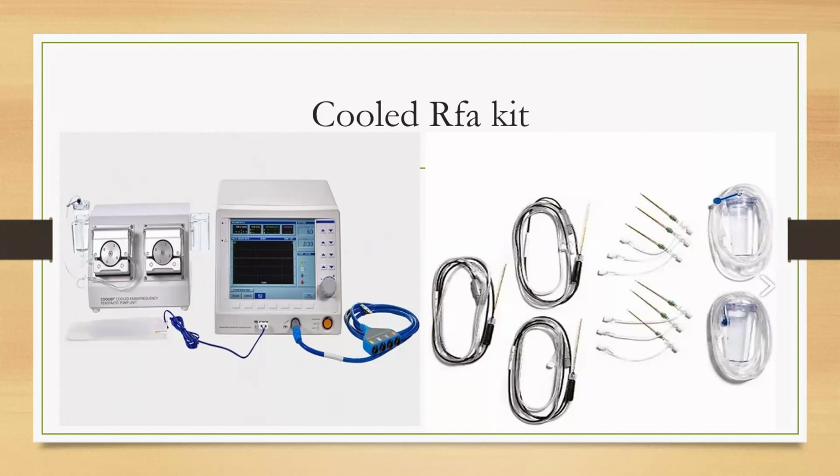Anyone? Charring won't be there in cooled radiofrequency ablation, sir. Okay, charring, and the gauge is of a higher size, the needle size. And what else? Cooled and conventional: in cooled RF the probe will be perpendicular.